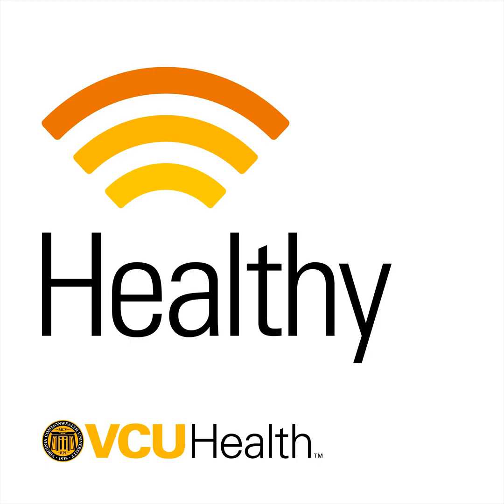Sure. Quick question. Do you have to shave all the hair or just the hair around that area? You have to shave all the hair, and not just clipped, but it has to be smooth. So this is important. We talk about this with our patients ahead of time in the clinic. They need to understand that it's not a negotiable thing. Once that's done, we have to place a frame on your head.